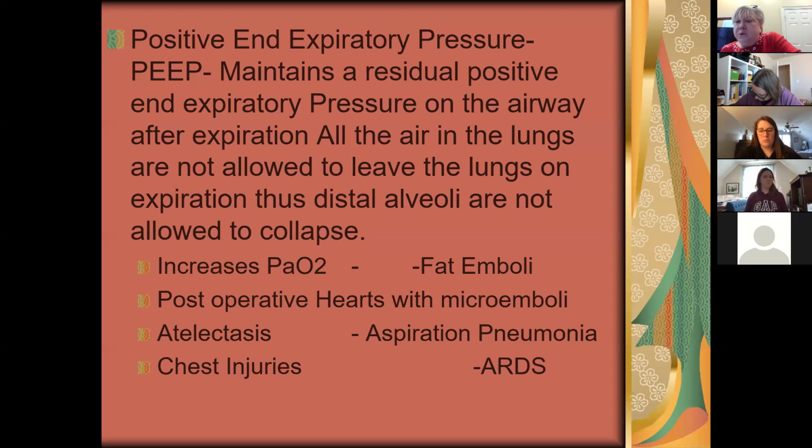Now, someone asked, is this what we call pressure support? Not really. Pressure support on a ventilator is like CPAP for people that are not on a ventilator. That's keeping the airways open, but they're breathing on their own.